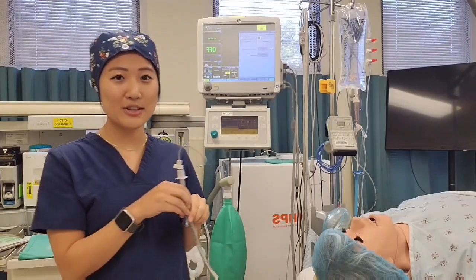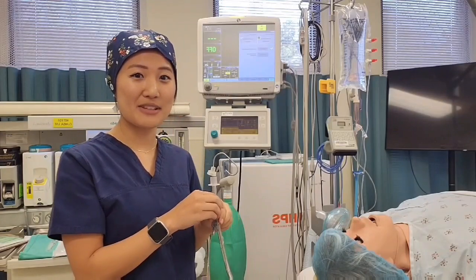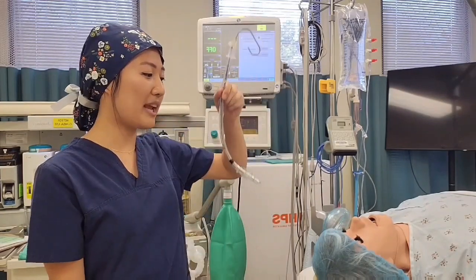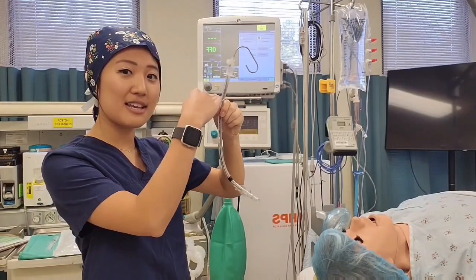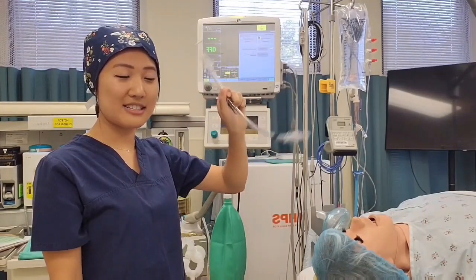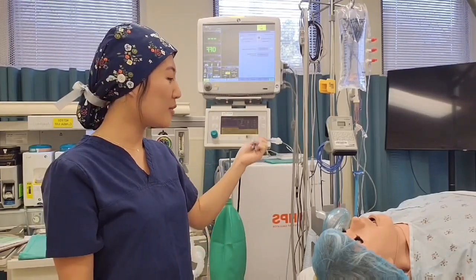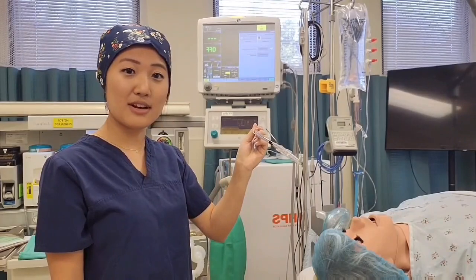When I was first learning how to intubate during simulation lab, my natural tendency was to introduce the tube from the vertical plane. This would obstruct my view of the airways and I would also have to flex my wrist to change the angle of the tube. My preceptor showed me this trick where you can introduce it from the horizontal plane.